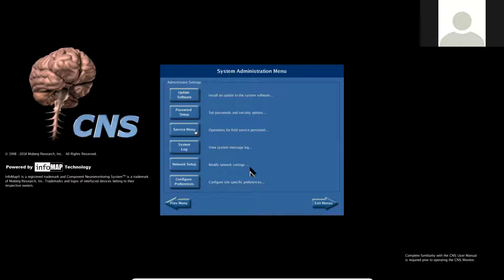So really they could just reach out to anybody, probably start with customer support and say, our institution is really interested in integrating our CNS monitor to the network, or if they have the contact information for their local salesperson. And then what would happen is we would set you up with a special project engineer. Currently, that's John Davis. We also have Vince working on that as well. And they need to have a contact within the IT department, and it really is a collaborative effort between the IT department and the Moberg engineers.